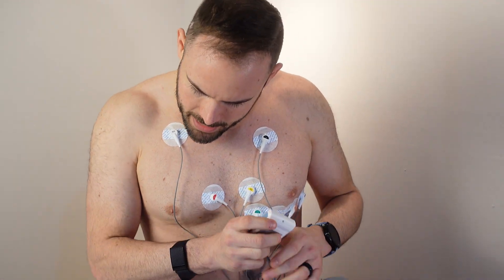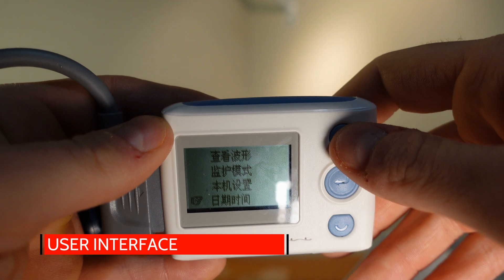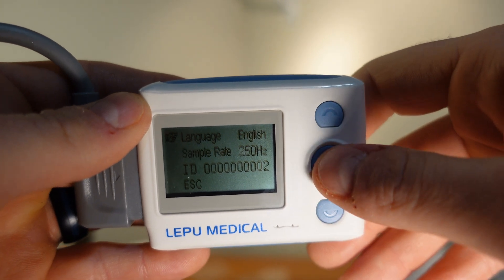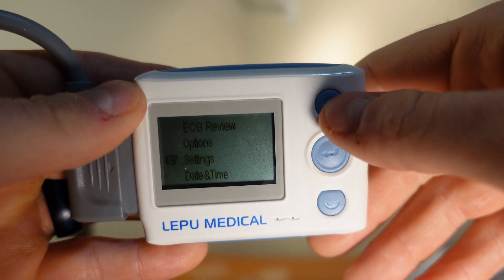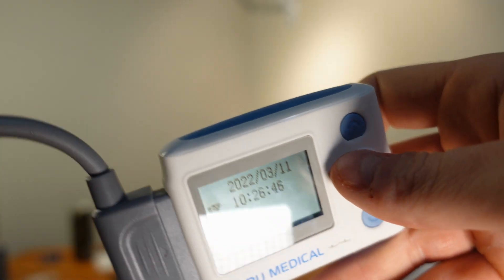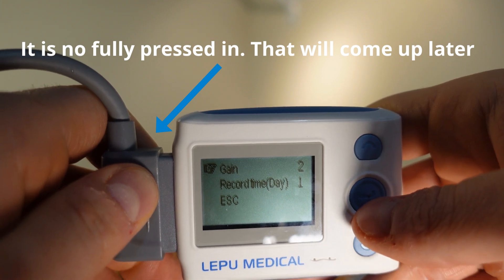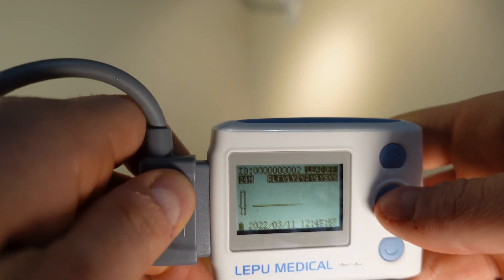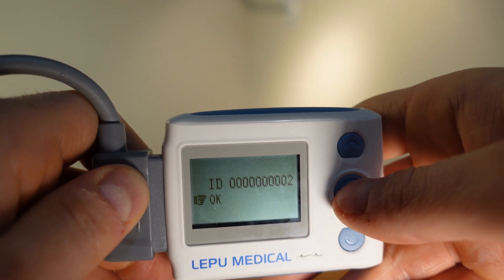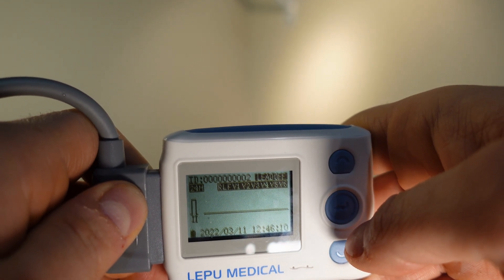With everything plugged in, hit the Enter button. One thing to note: if it's set to a different language, go to the second-to-last option at the bottom, click the top, and switch down to English — that makes things a lot easier. You can also switch the ID if you like. From here we need to set up the date and time — it's 2022. Then go into options for gain and recording time, selecting how many days you want. Hit the menu button, then start recording, hit okay, check the ID number, and hit okay. It will format the SD card and then start recording.